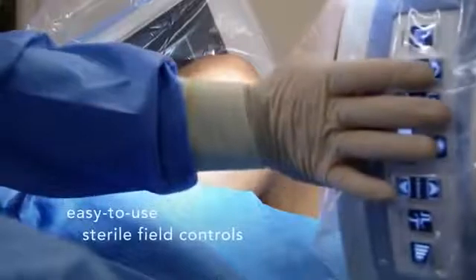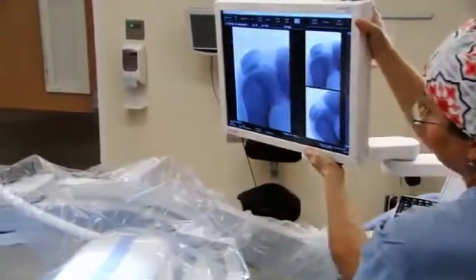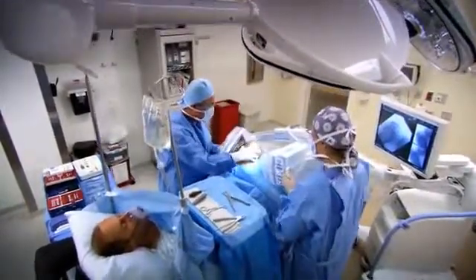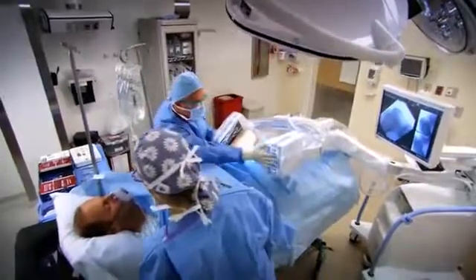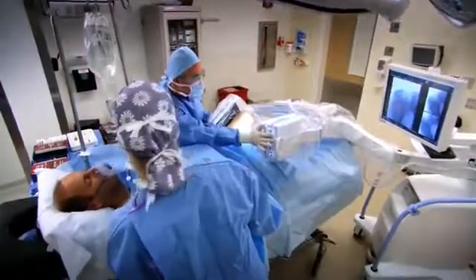The sterile field controls are intuitive and easy to use. Even the touchscreen interface is simple to reposition, allowing for increased workflow. Everything about Fluoroscan Insight FD is engineered to reduce time spent adjusting images and leave you free to focus on the patient, because the most useful instrument is one that stays out of your way.